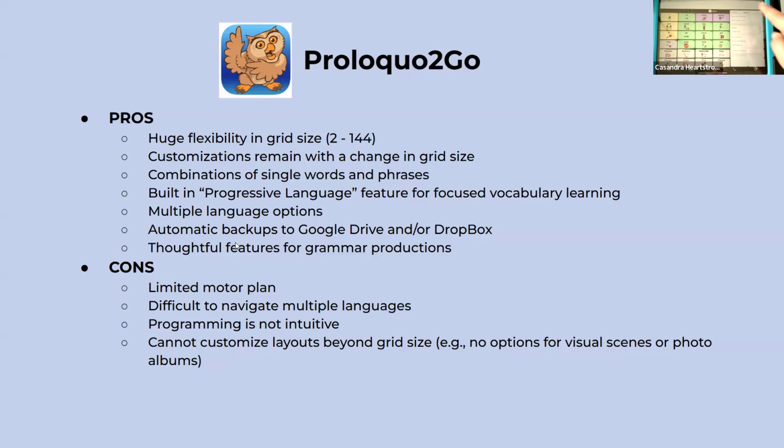And it's got thoughtful features for grammar production. So if I hold this button down, it will let me choose different versions of the word. Like, you can change the voice. That's just the voice I have on here.